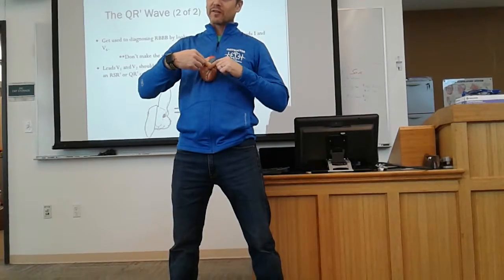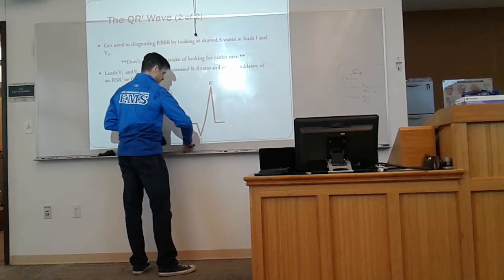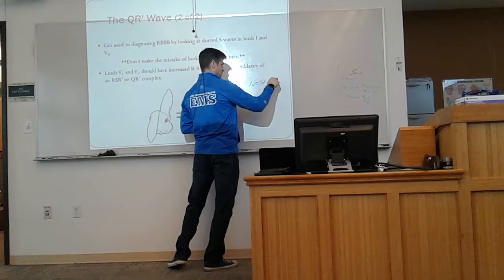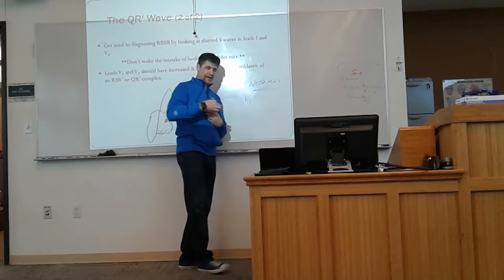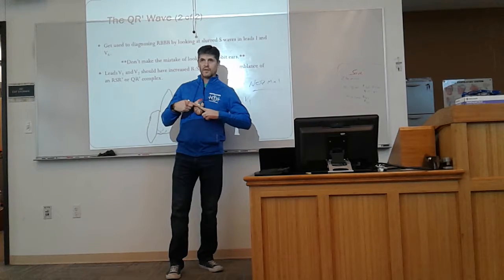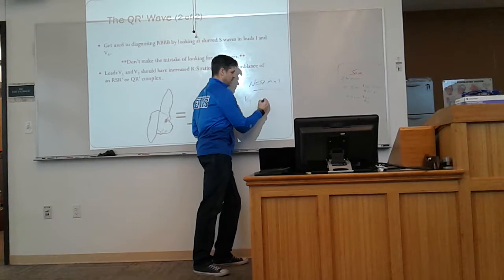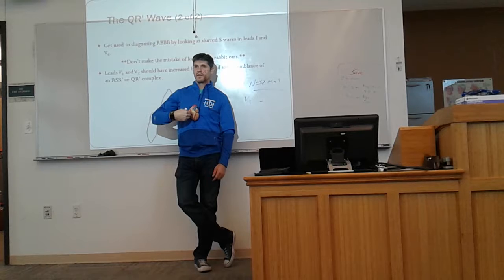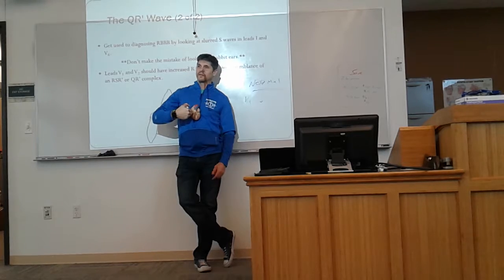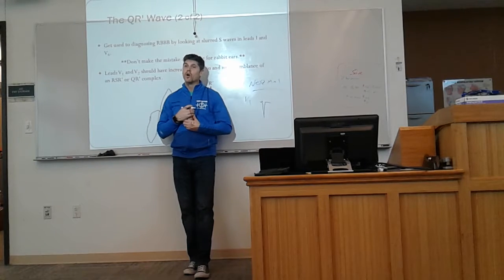I see a little tiny bit of the septum, right, that fires, and the start of the right side that fires, which is going directly at V1, because V1's right there. But then the majority of the electrical activity is firing where compared to V1? Away from it. So that's what my V1 normally looks like.